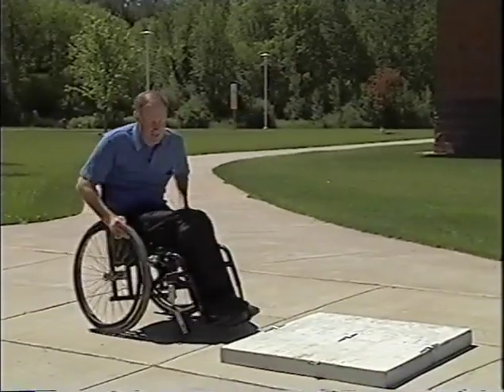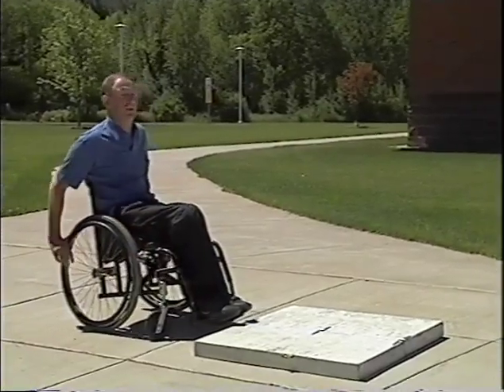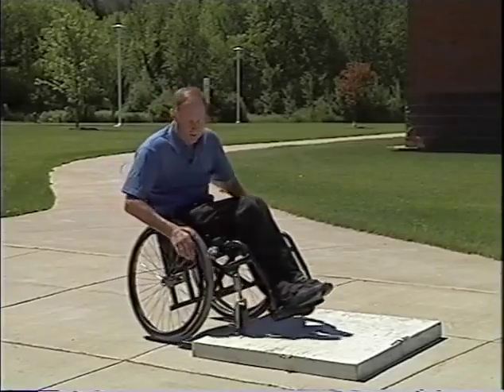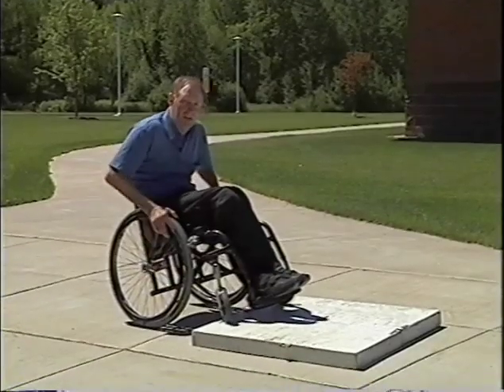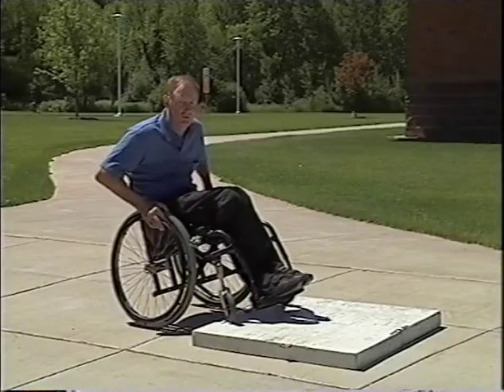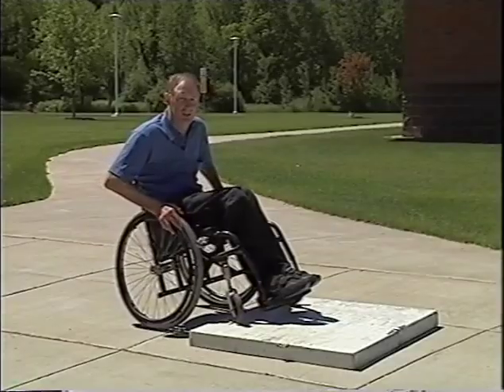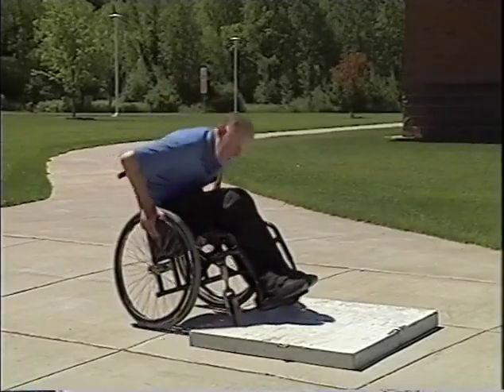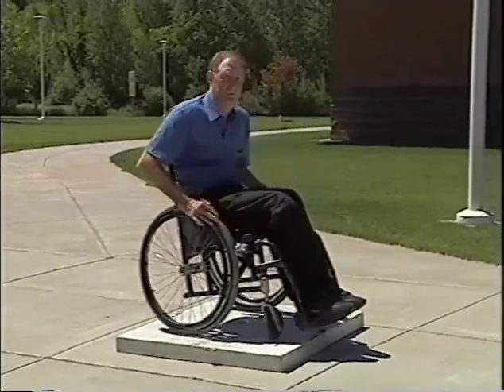So let's look at that again. Pull up to the curb. Get your weight behind the axles. Pull that little wheelie. Place your front end on the curb. Back up as far as you can. Put your hands in front of the axles. Throw your weight forward and then push. Make sure you throw your weight forward before you begin the pushing because you'll pull a wheelie very easily while you're already in one. So just weight forward and then push. And you're up.